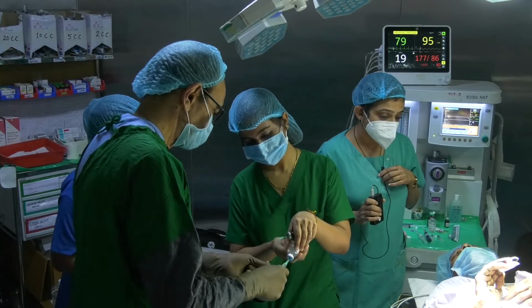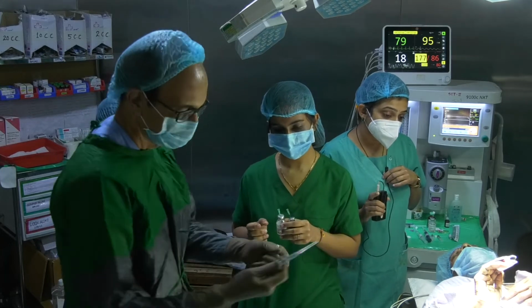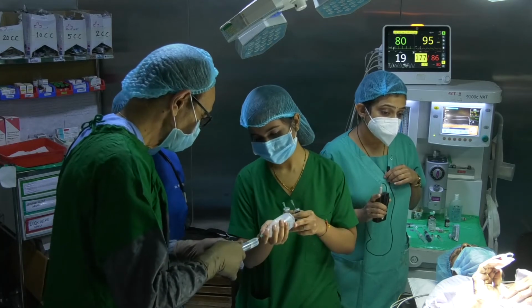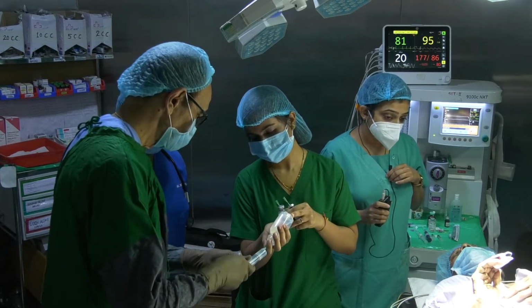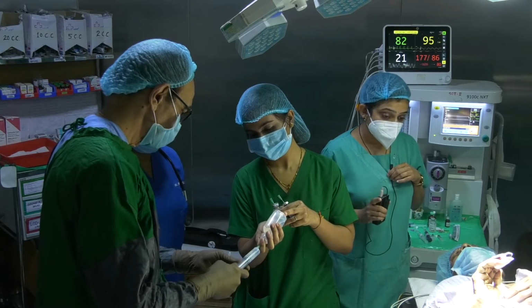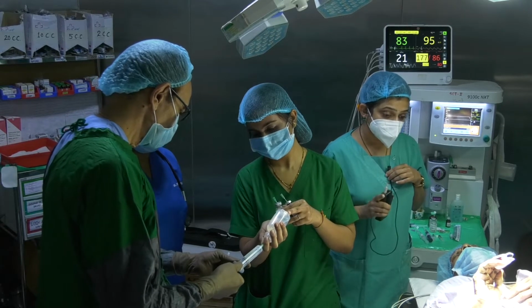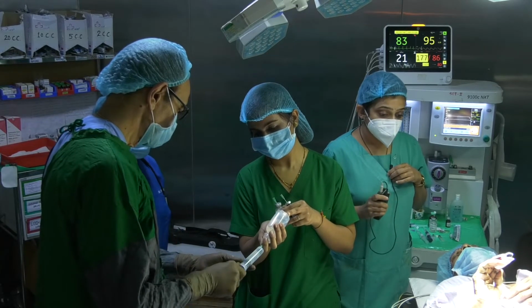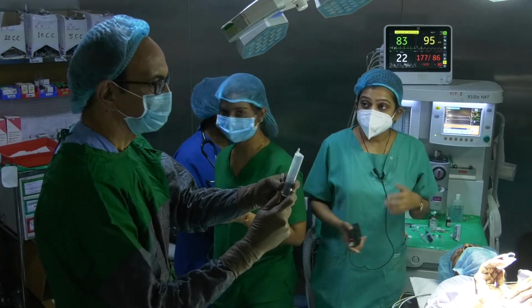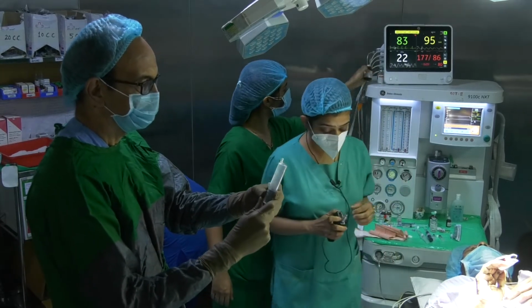Consent has been taken. He is posted for intertrochanteric fracture right side for right-sided proximal femoral nailing. So we will be demonstrating a fascia iliaca block on the right side first, then he will be turned to the left lateral position and continuous spinal anesthesia will be demonstrated. Now sir will describe the procedure while performing the block.